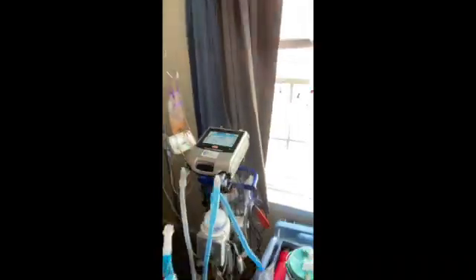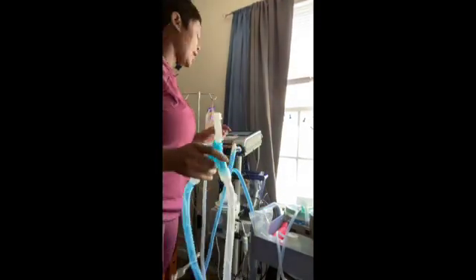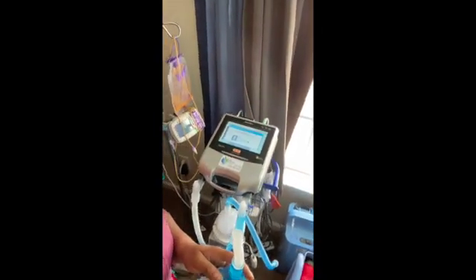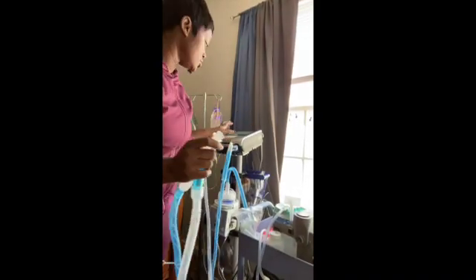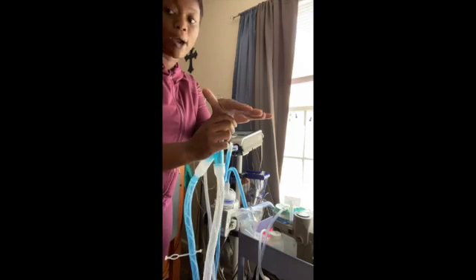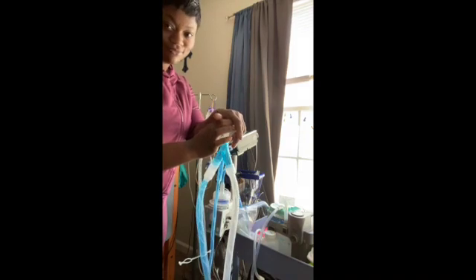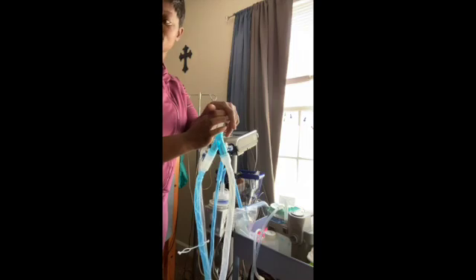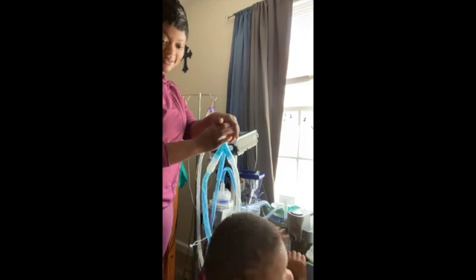It should make that noise when it's testing. Now the next step says: block the end of the circuit. That's exactly what you're going to do — block the end of the circuit. You can wear a glove if you want to. Press 'Continue' and quickly block the end of the circuit. It's tested!